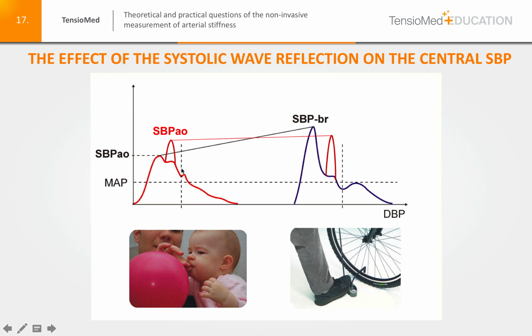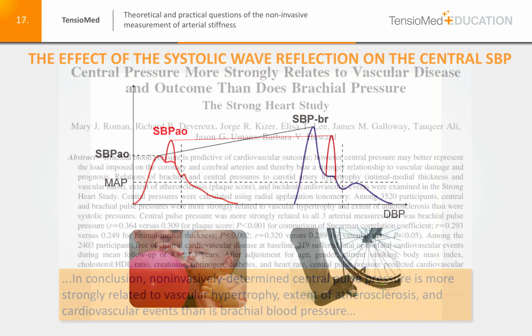While the pathological process has already occurred in the aorta, because despite the still normal brachial blood pressure being less than 140, we could see the increase in the augmentation index and increase in the central blood pressure in the aorta. Thus, the pathology is going on. However, this could not be detected by the peripheral brachial blood pressure measurement.